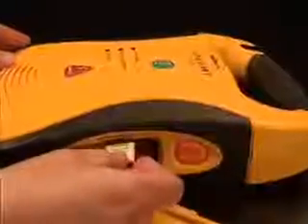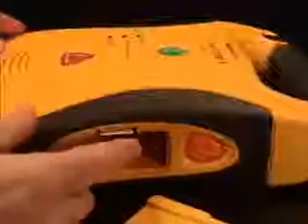Insert the card, label side up, angle corner end first, into the slot. Push in the data card until it clicks into place. When properly inserted, the data card will be flush with the end of the slot. To remove the data card, push the card in until you feel it click. The card will be partially ejected out of the slot and may then be removed.